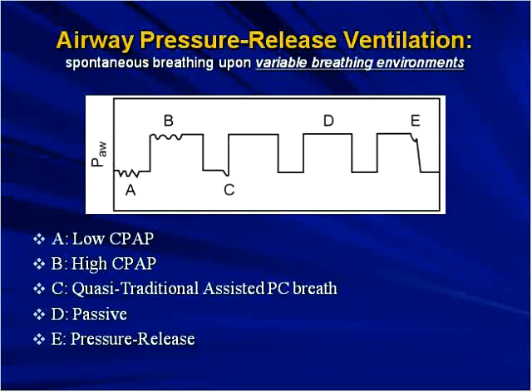Talk a little bit, very, very briefly, about airway pressure release ventilation, because it kind of follows along with IMV.